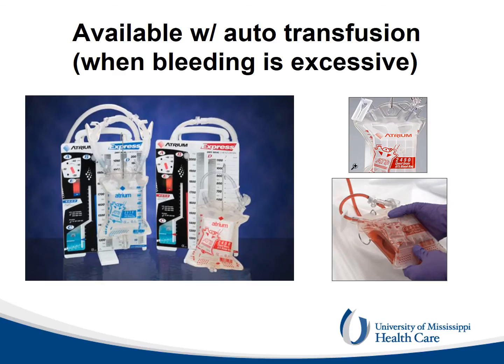When the patient is not walking, the floor stand needs to be in the open position, perpendicular to the CDU, and taped to the floor to reduce the chance of it being flipped over. In patients who have a large hemothorax, usually from trauma, it is possible to collect the drained blood and retransfuse it to the patient.